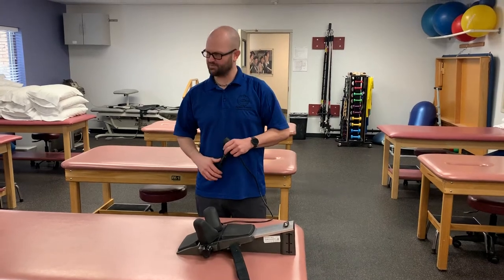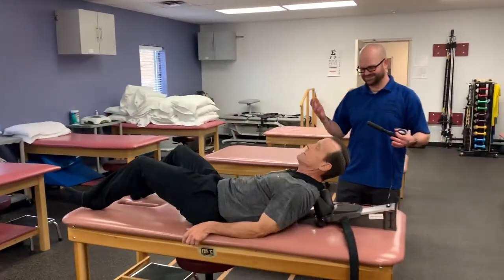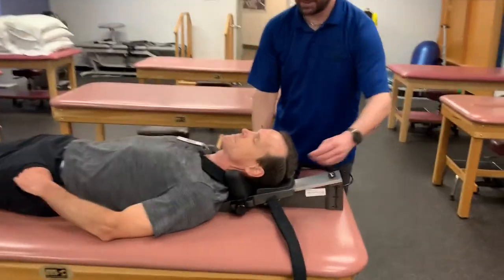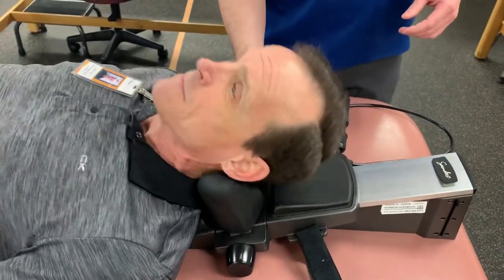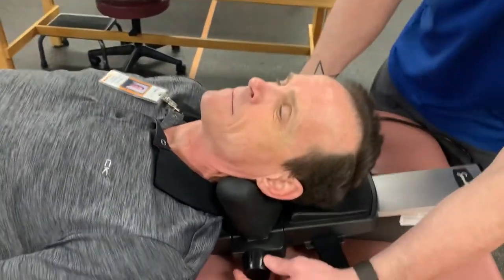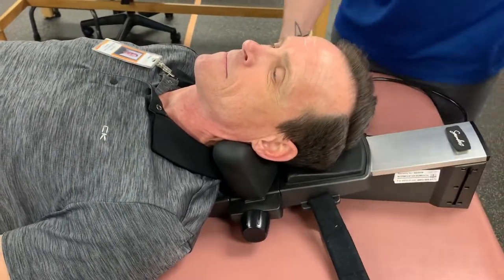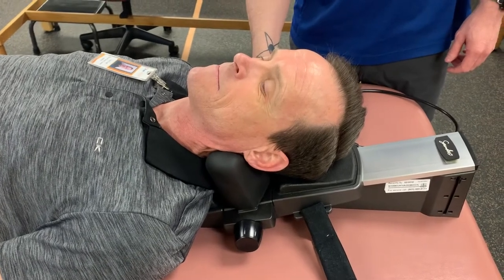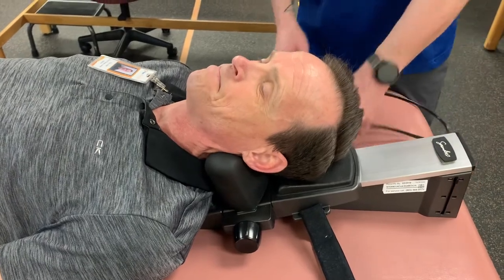So we have our patient come and lie down and place his head there, and we check to make sure the cushions are in contact. We'll take this and tighten it up just until it's comfortable for the patient. If it causes pain or is uncomfortable then let us know. Does that feel okay now? Mm-hmm. Okay.